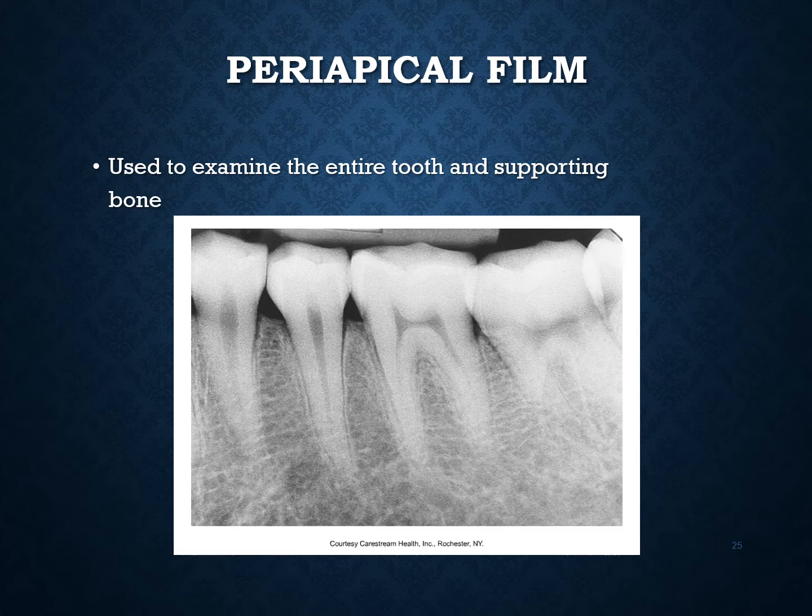So when we are talking about periapical, we mean this space around this, this being the apex of the tooth, and this around it, that's what we're looking at. This type of film shows the tip of the tooth root and surrounding structures, as well as the crown. It's important that we don't forget that we still have to get the crown of the tooth. We can't cut that off, and it wouldn't be a diagnostic image if we cut off the top of the tooth. But it's also not a diagnostic image if we can't see any of this space down here. We have to see this area around. You should shoot for maybe 2 or 3 millimeters of bone around and underneath the apexes of these roots.